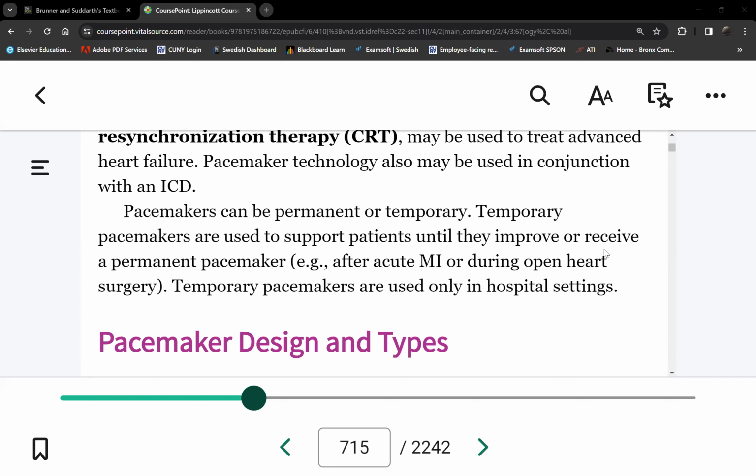The patients who require immediate pacemaker therapy, so let's say the third-degree heart block occurs right now. Okay, so let's say Miss May Jean has a third-degree heart block today. We gave her up to 3 doses of atropine, no luck. Heart rate remains in the 30s. So we applied a pacemaker.